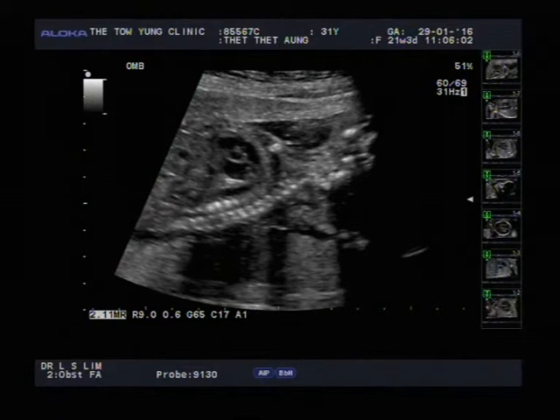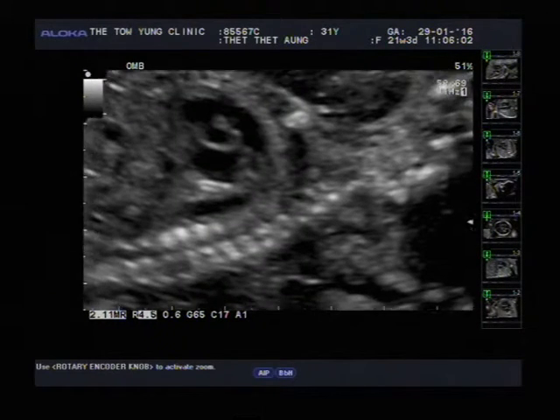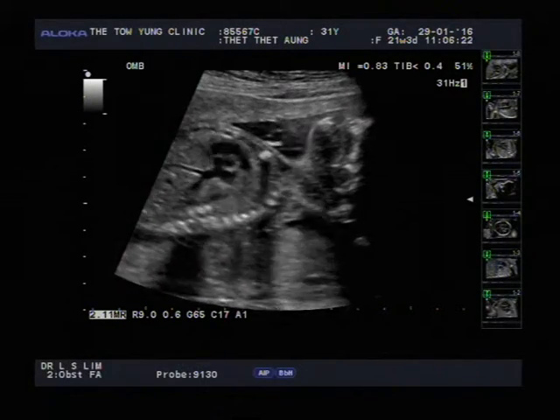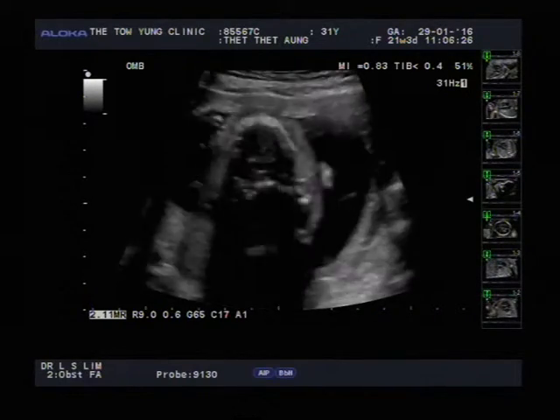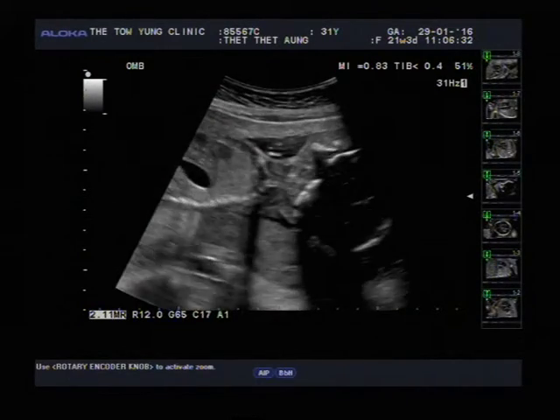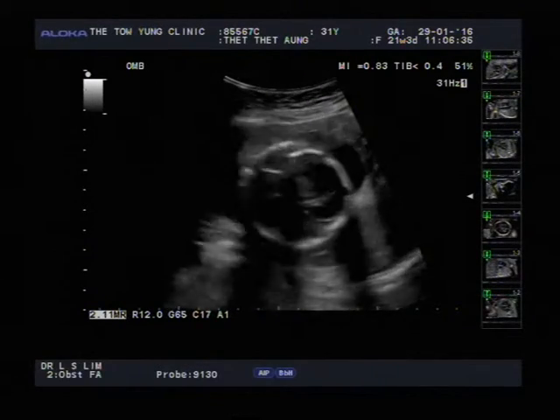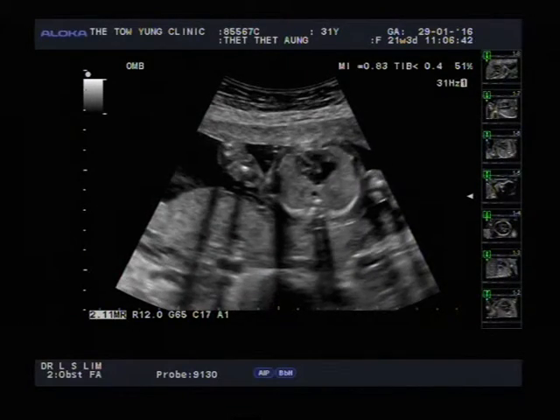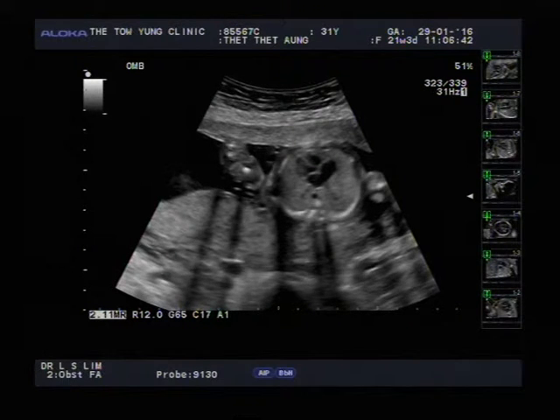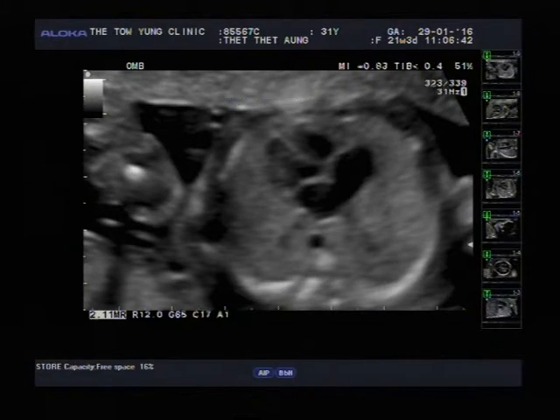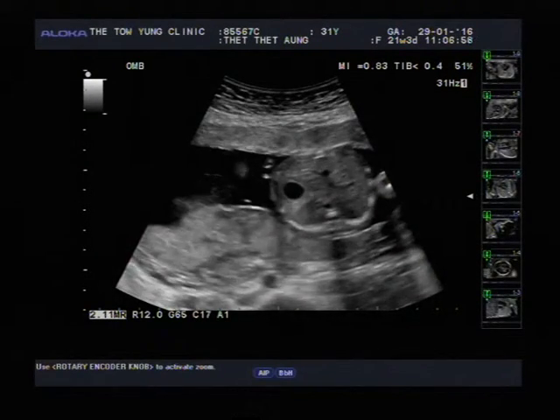That was a very good view of the baby's right ventricular outflow tract. Going back to the baby's head and brain — the angle is not very good for showing me the posterior brain. I'm going to go back to that shortly. Let's go from below the heart — here's another good four-chamber view. A nice view of the right and left chambers — I'm quite happy with your baby's heart overall. There's the stomach and the liver, shown in cross-section.